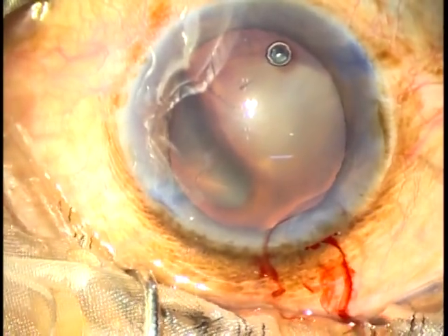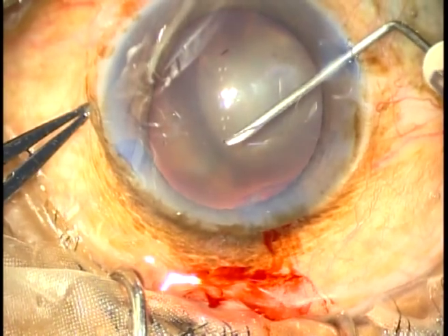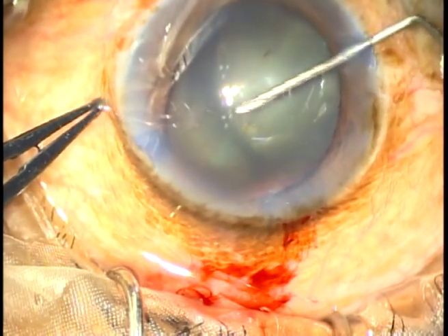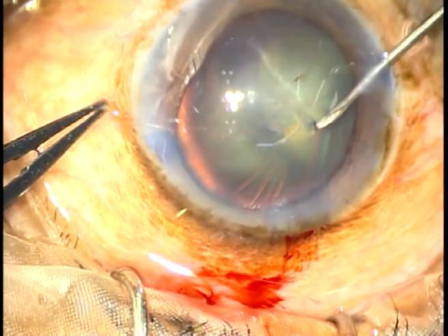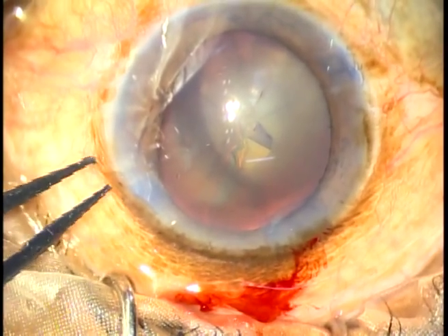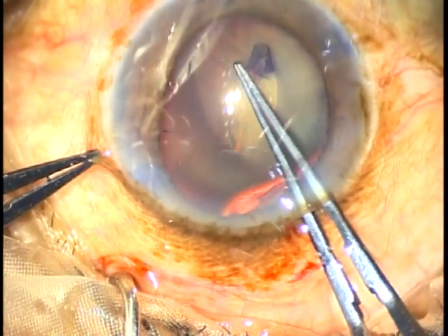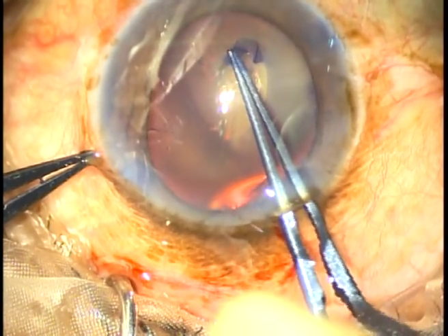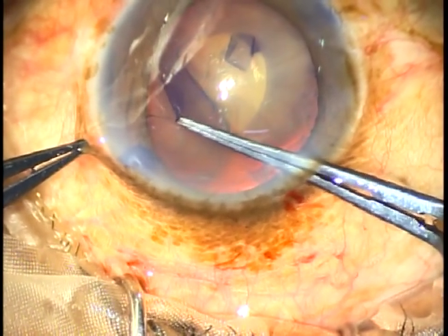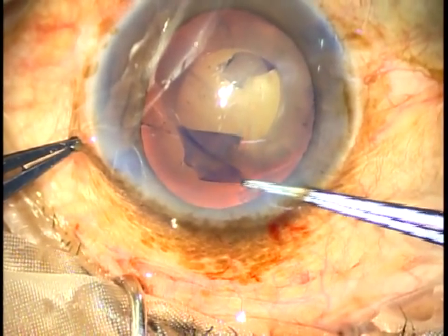Now I want to do capsulorhexis. As I try to make a puncture on the anterior surface, I find that there is wrinkling of the anterior capsule and the whole lens moves. This indicates general weakness — general dehiscence at some point. In this case, there is zonular tear centering at 3 o'clock. Very gently, very cautiously, without any jerky pull, I am doing this capsulorhexis.